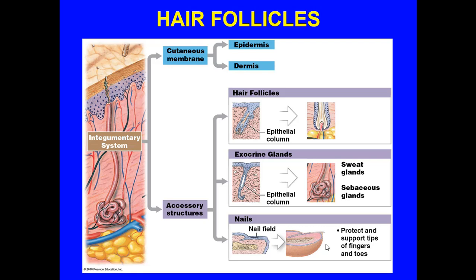Pulse oximeters used to be a big, massive device, and you'd wrap this little IR beam through the skin and it would be detected by another type of photoreceptor. Now we've got these little devices that clamp on the tip, and they can electronically, by Bluetooth, go right over to the doctor's laptop, or you can read the numbers right off of this little device, and it's fantastic. But let's move forward.